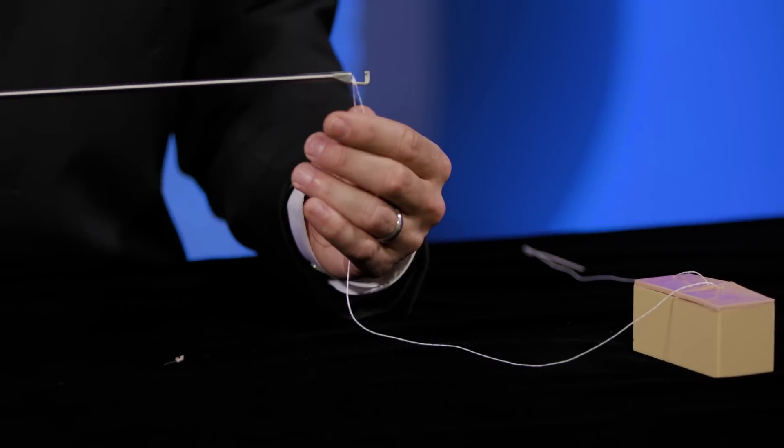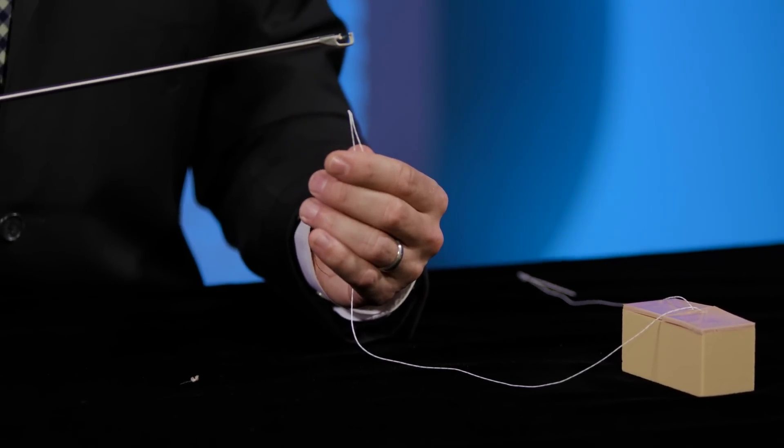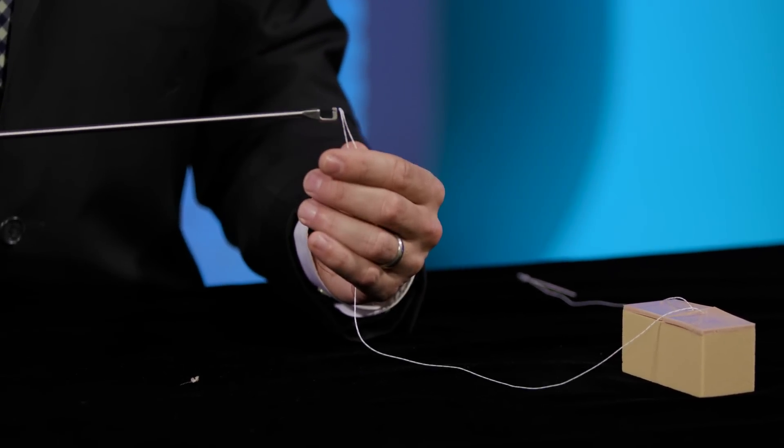To release the suture from the needle, you'll simply apply some downward pressure to the suture and squeeze the back of the handle without squeezing the front trigger. Pull the suture down and it'll be released from the needle inside the device.